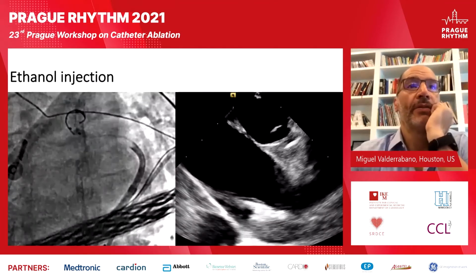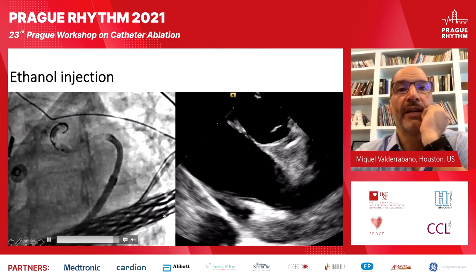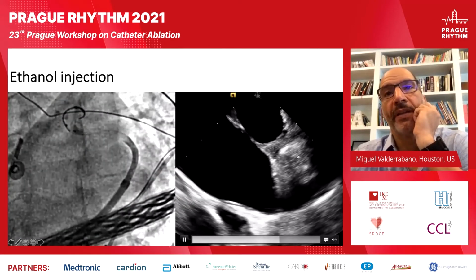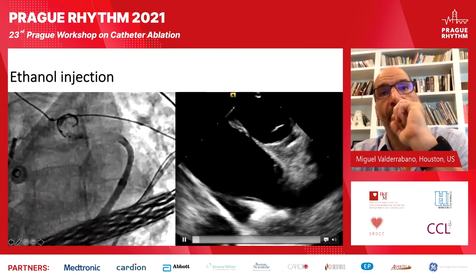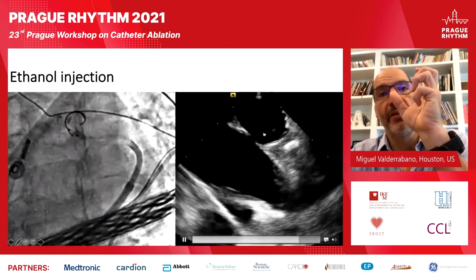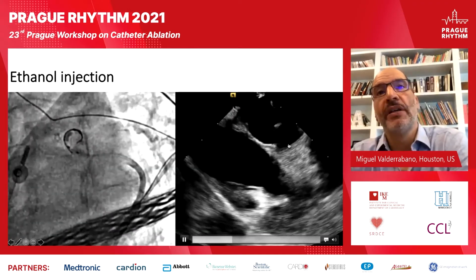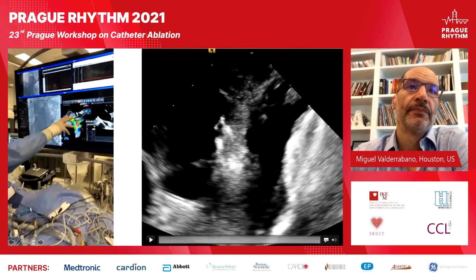I want to show you how it looks as we give alcohol. You get the myocardial staining, and on intracardiac echo you see bright spots showing up in the intramural LV summit muscle. So this is a view from the catheters in the RV outflow. This is the aorta. This is the atrial appendage. Here, muscle of the LV summit. Echogenic. So we have delivered 3 injections of alcohol.